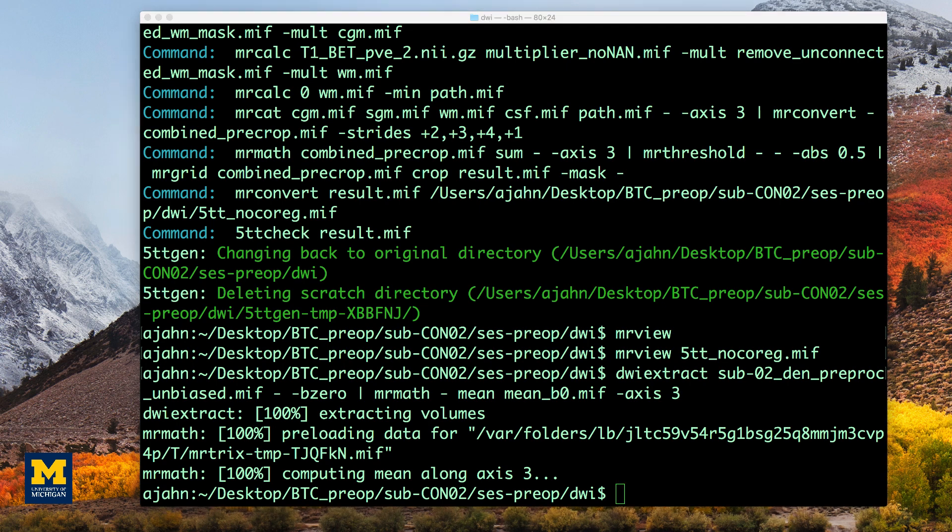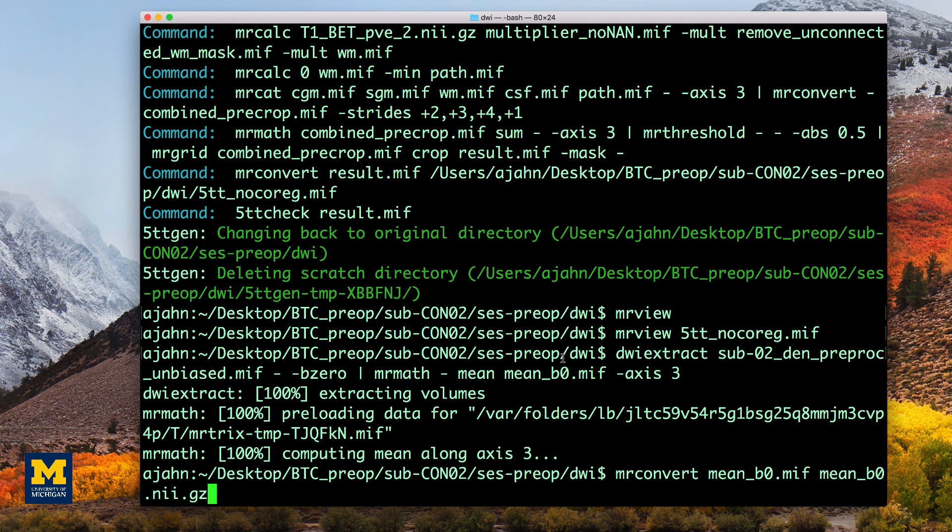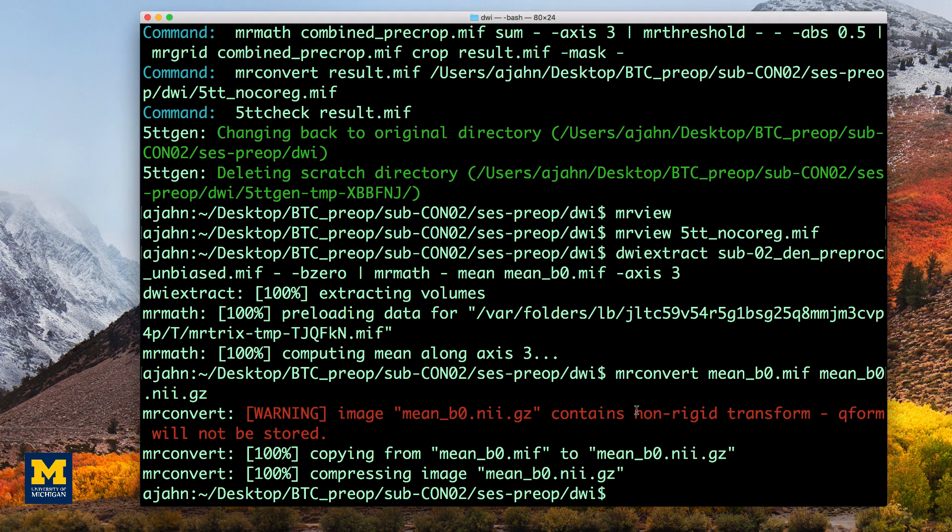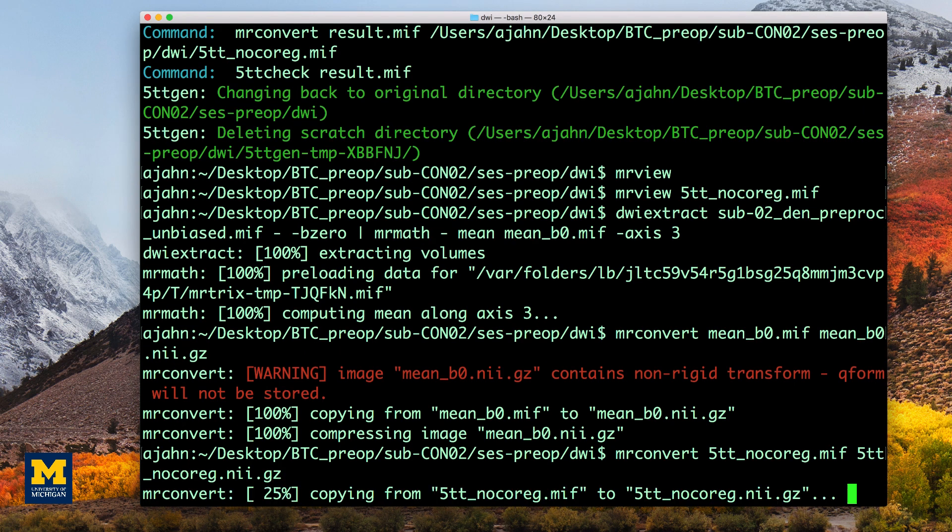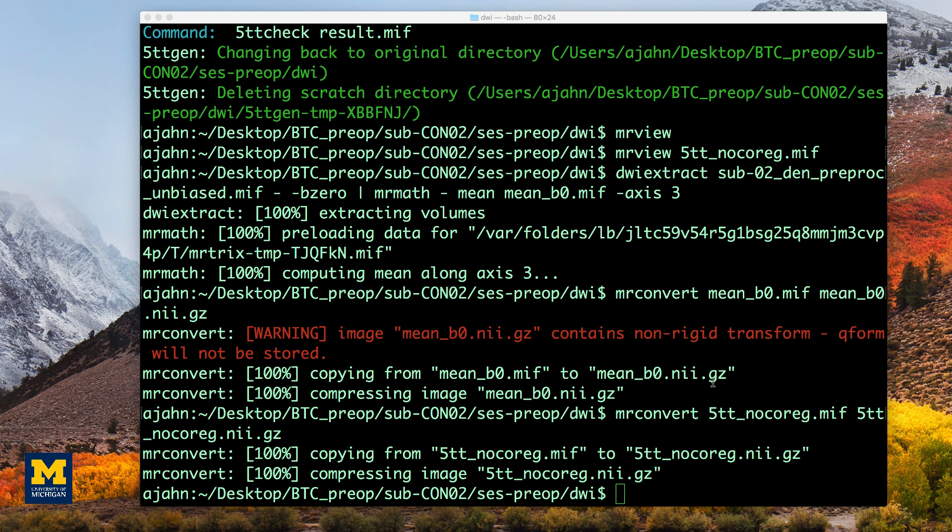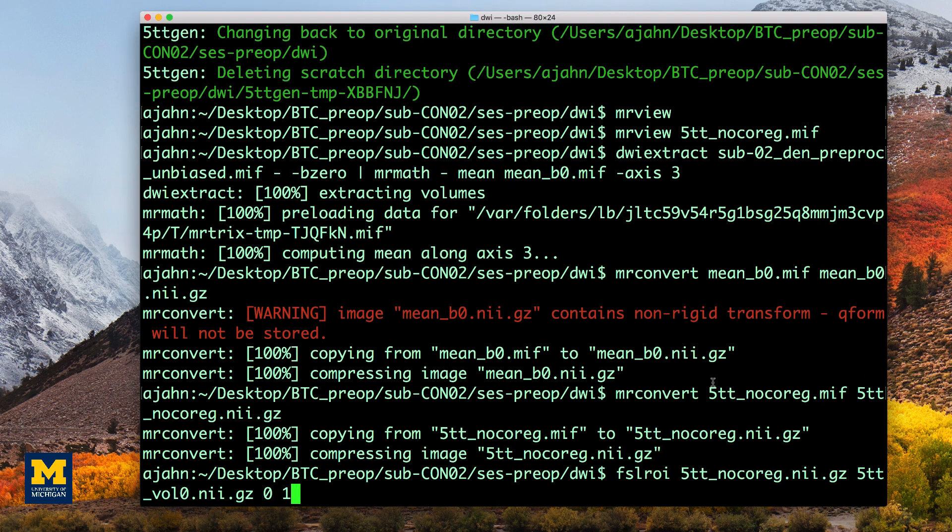The first step is to convert both the segmented anatomical image and the B0 images that we just extracted using the mrconvert command. Since FLIRT works with a single 3D image, we will use FSL-ROI to extract the first volume of the segmented dataset, which corresponds to the gray matter segmentation.